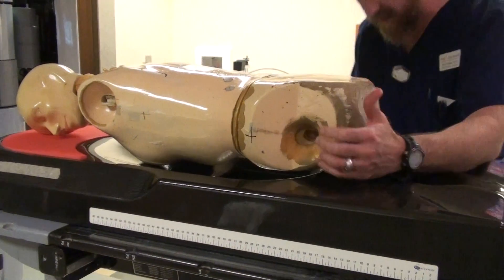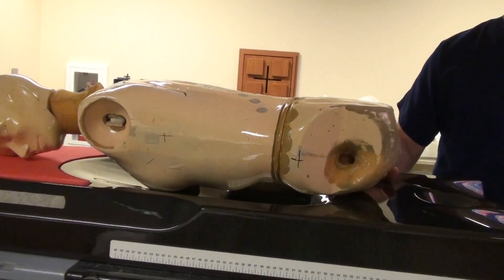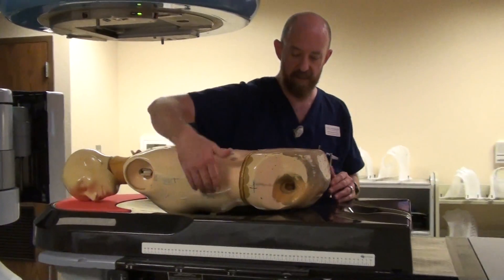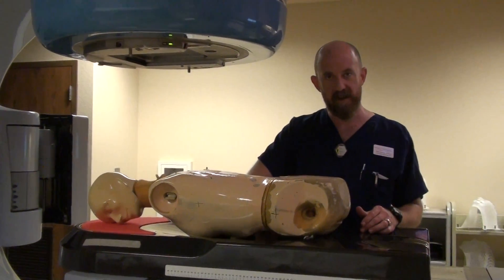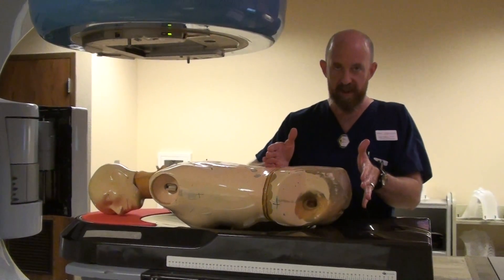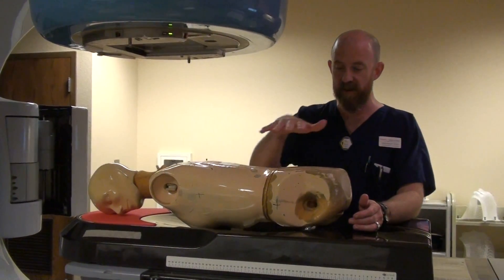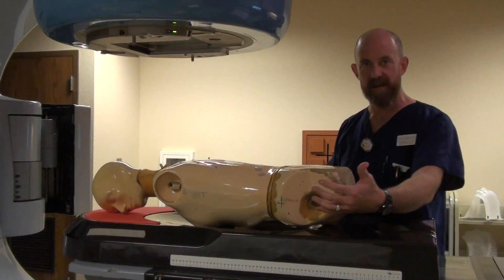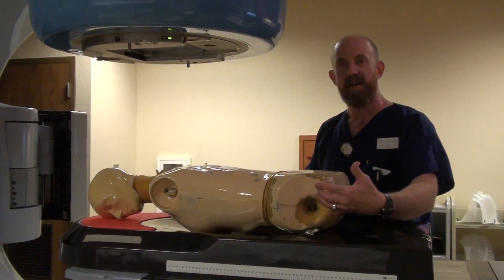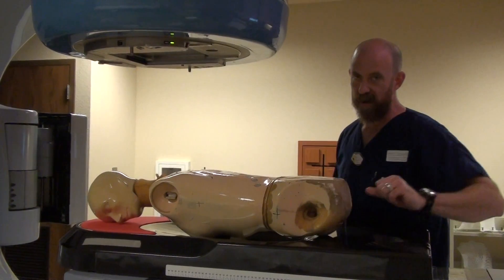You want the symphysis to be right on the edge of the inferior edge of the belly board hole. What that does is it allows the soft tissue of the belly to fall into the hole, and it falls anterior from any treatment portals you may have. This is typically done on a three-field technique. If you're treating with a PA and two laterals, those laterals can be relatively large. You want the smallest amount of small bowel as possible to come in contact with that treatment field, so we do this so that it falls anterior to any lateral treatment fields.